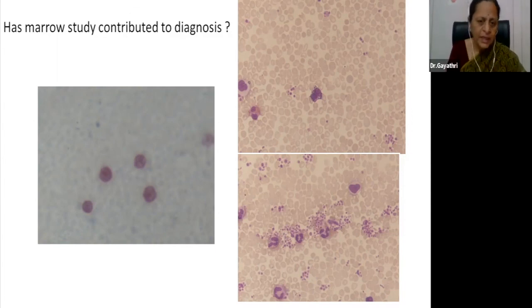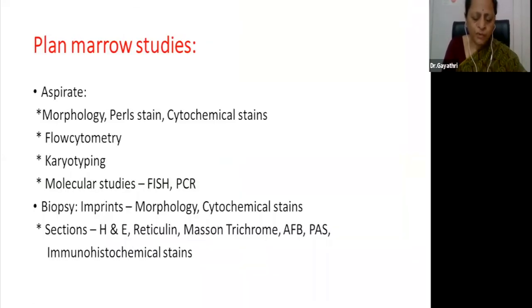So in such a case, earlier we used to do what is called leukocyte alkaline phosphatase, or neutrophil alkaline phosphatase, and differentiate leukemoid reaction from CML. Now, of course, we have specific tools, but these were the historically important stains that were used earlier, before we had access to molecular testing.